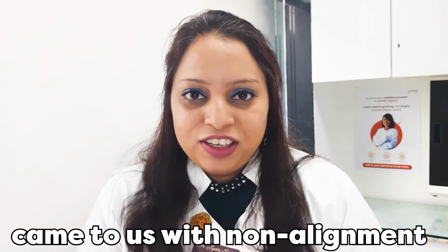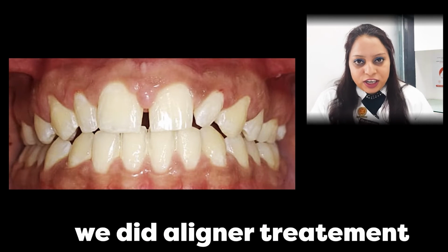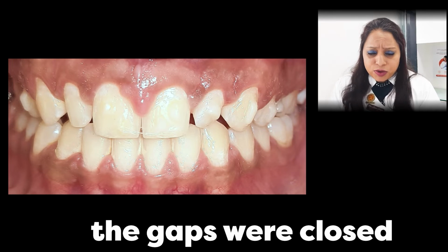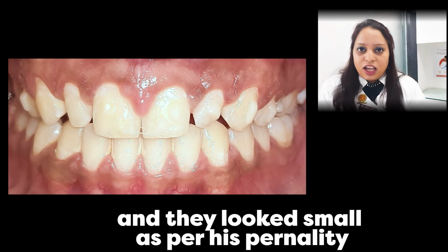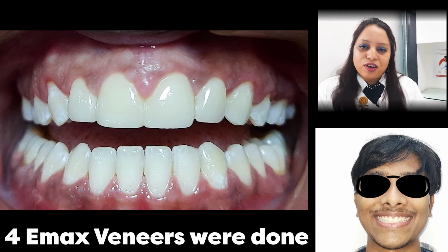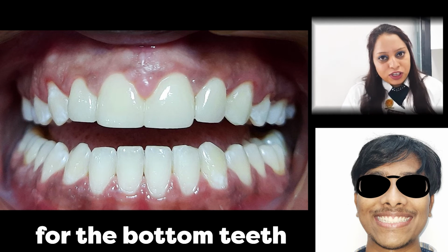The next patient came to us with non-alignment of teeth. Initially, we did aligner treatment for him. Although the smile was corrected and the gaps were closed, he was not happy with the size and the shape of the teeth. He had peg-shaped teeth and they looked very small for his personality. So for him, 4 Emax veneers were done. Teeth whitening was done for the bottom teeth to match the shade.